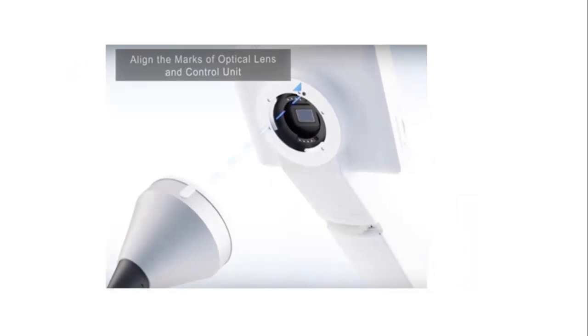To attach the lens, ensure power is off and the device has been removed from the charger. Find and match the lens alignment marks, small black circles, on both the Horus Scope and the lens. Insert the lens into the Horus Scope connector interface.